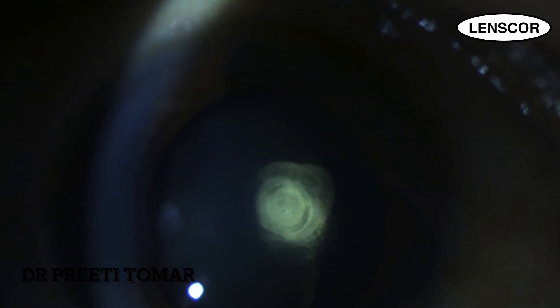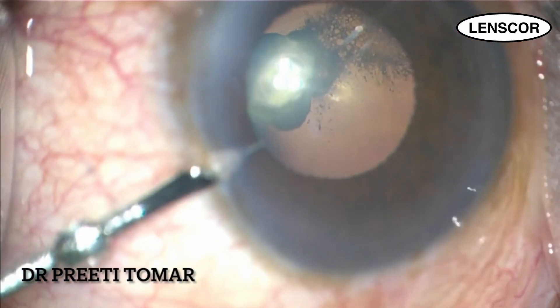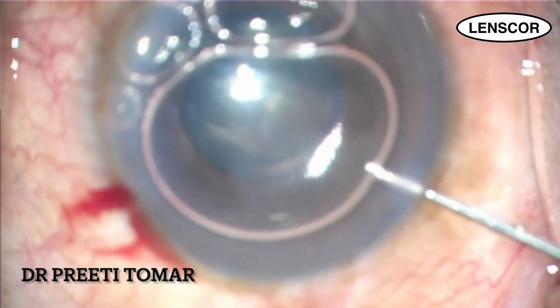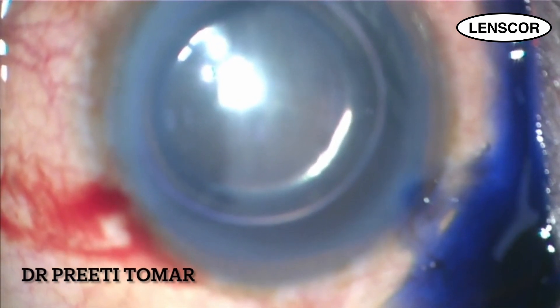Hi, this is Dr. Preeti Tomar and in today's video, I am going to give you some important surgical pearls to keep in mind while doing phacoemulsification in a case of posterior polar cataract. This is a 34-year-old patient who presented with complaints of diminution of vision in my OPD and was advised cataract surgery.